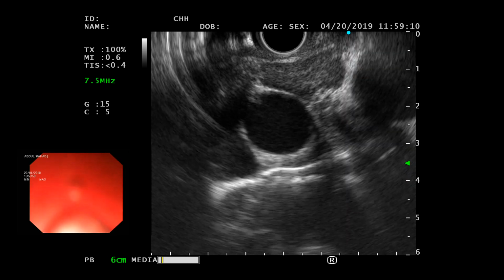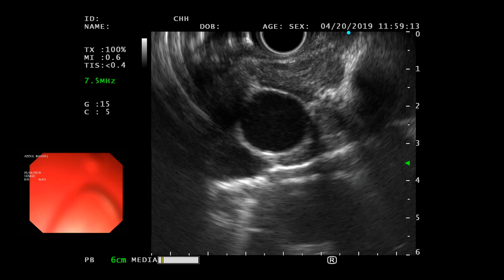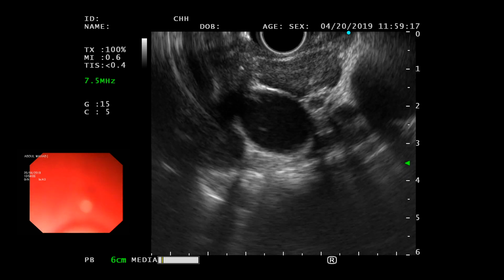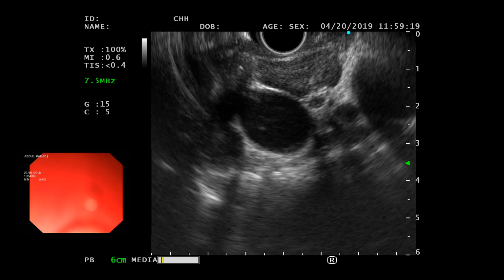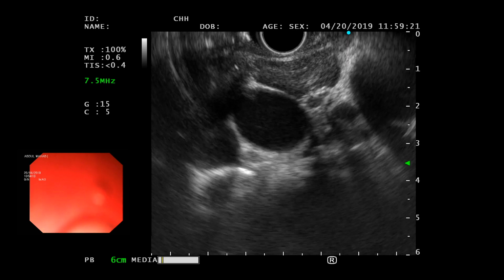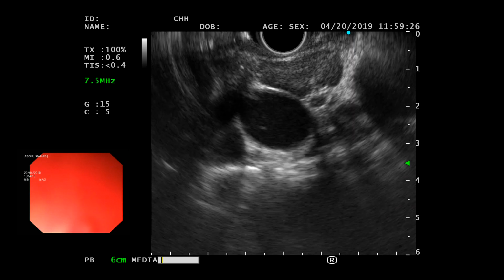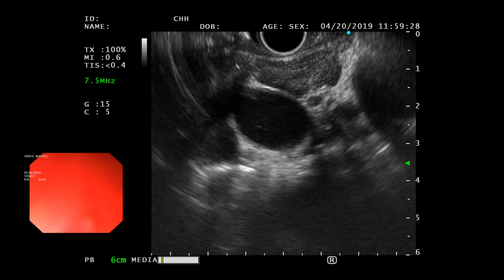अच्छा, साथ में जब आपने ये celiac block किया, सिर्फ इसको जरा सा ऐसे करके वापस निकाल लिया था या नहीं? You just stay there. You don't want to move. Once in celiac block, once you've got your needle in position, nothing should move. Inject everything out.